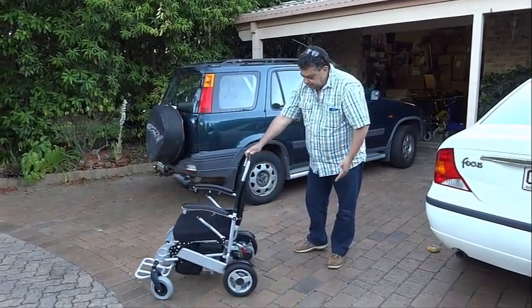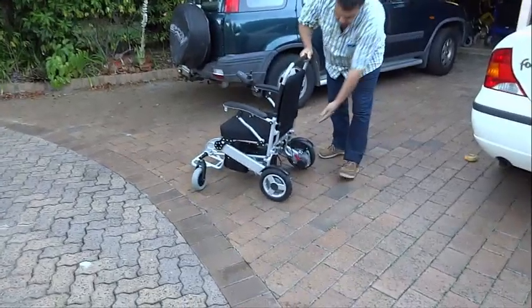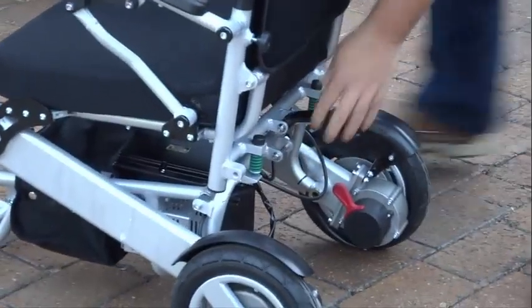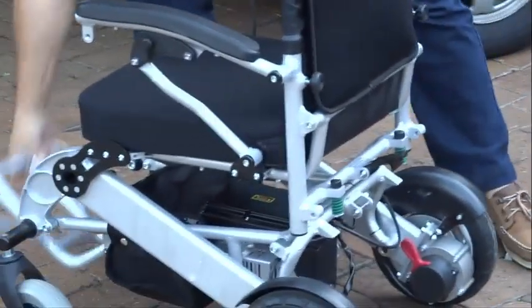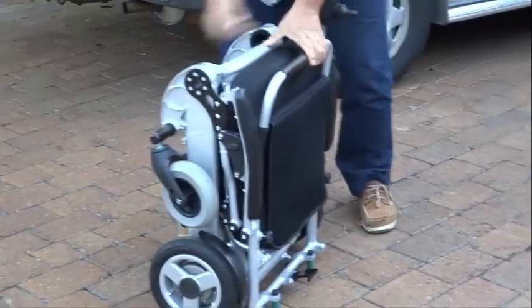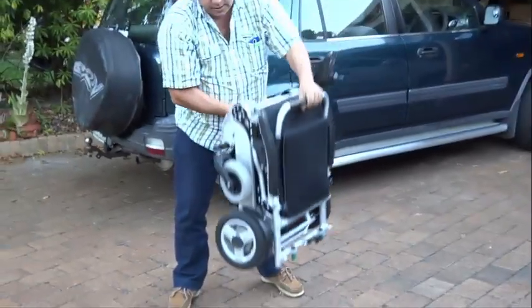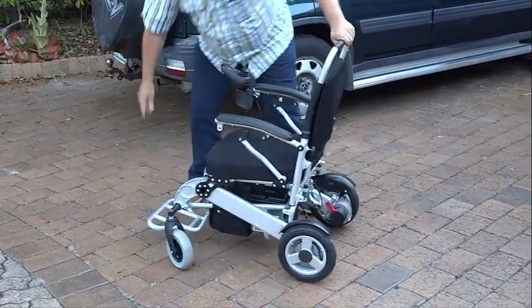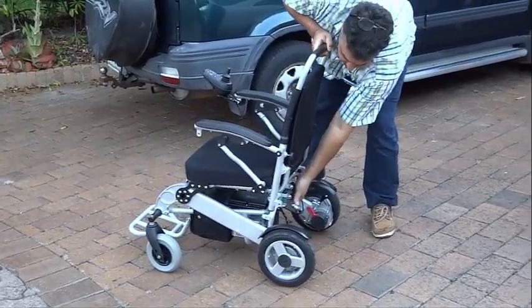Note that the centre of gravity for the Grand and Super Grand is quite far forward, so you will not need anti-tip wheels on flat surfaces, but as soon as you use it outdoors or on ramps they are crucial. They simply clip on and off the back of the wheelchair, but remember the wheelchair cannot fold while they are clipped on — you have to unclip them first.